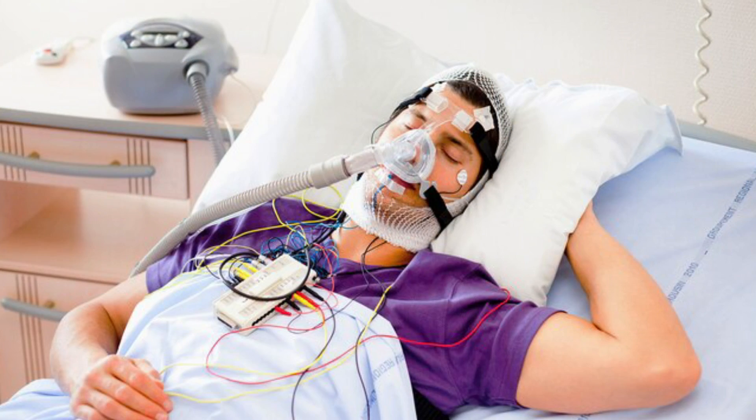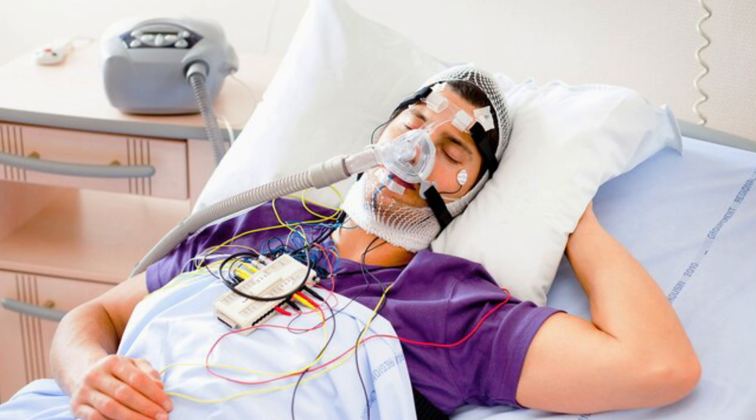Those of you who have previously done a sleep test would probably report back that it's not the most enjoyable experience in the world. Getting all those wires put all over you and things up your nose and then being asked to go to sleep now and we'll monitor you through the night and make sure you're breathing okay.